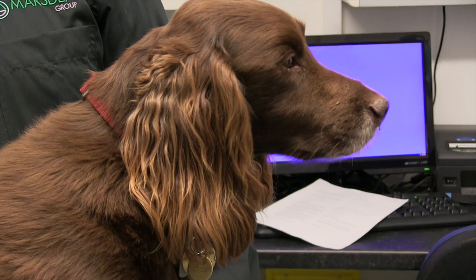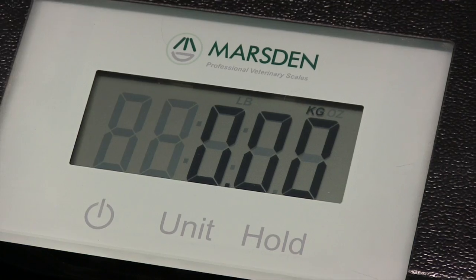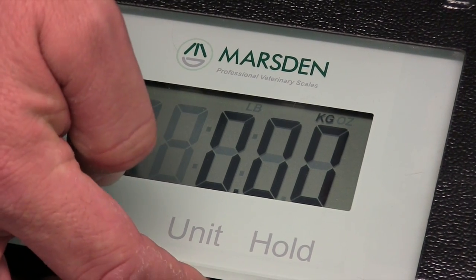The scale will hold your pet's weight, giving you plenty of time to take a note of it. The V100 has a capacity of 100 kilos, weighing to the nearest 50 grams. It also has a units button that switches you from kilos to pounds.